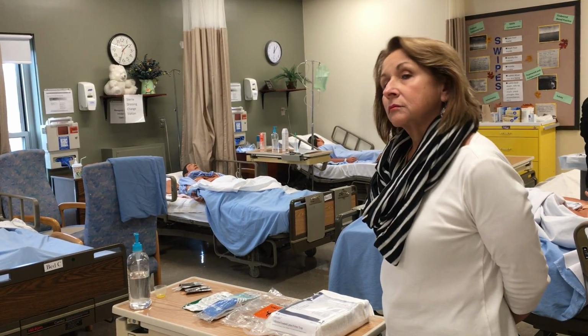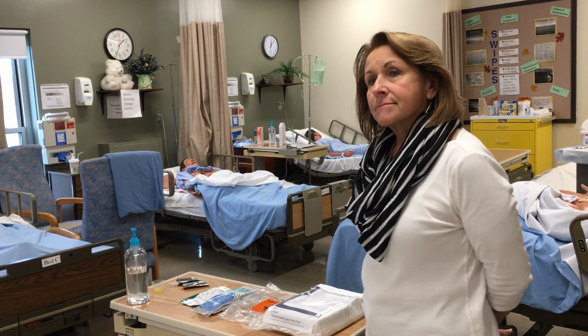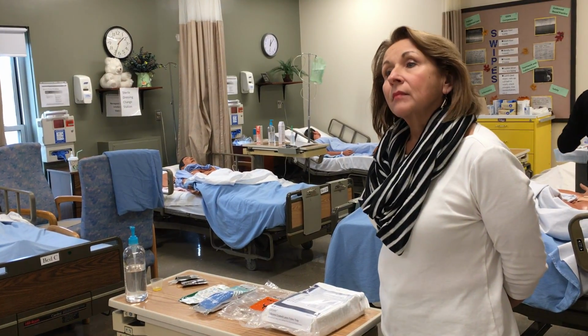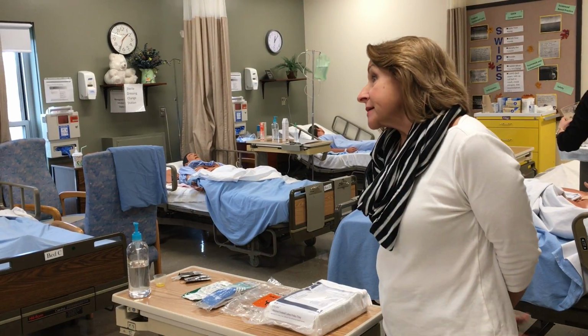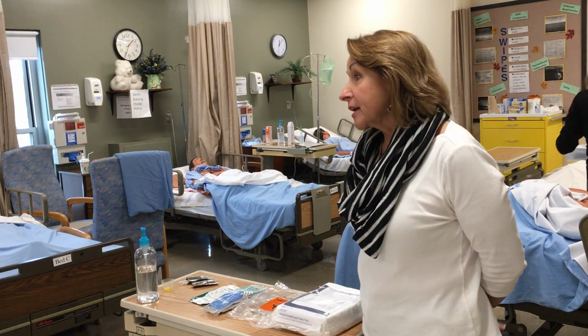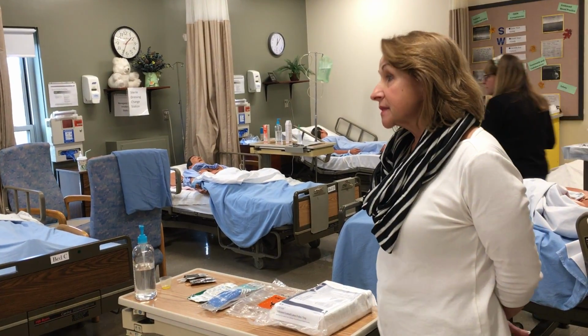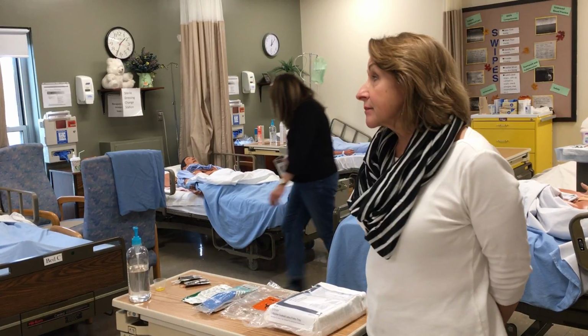All right, when you use a straight catheter and intermittent, for what purposes? If they don't need constant drainage, so if they are paraplegic and use a wheelchair. Okay. Intermittent, as much as you can to avoid the indwelling. Specimens, self-catheterizations, people who have neurogenic bladders and cath themselves, maybe a post-void residual if you don't have a bladder scan machine.